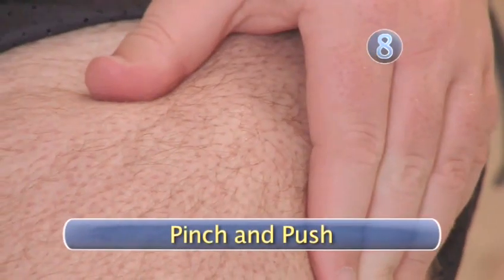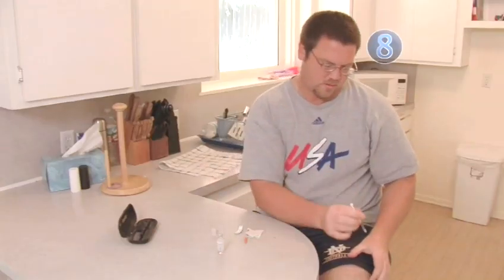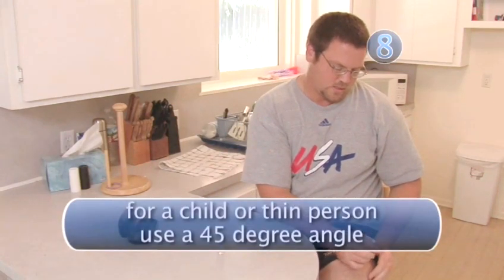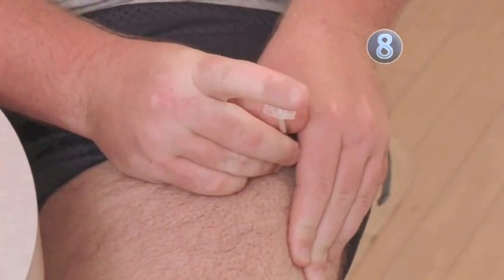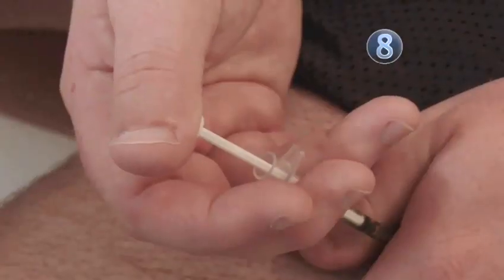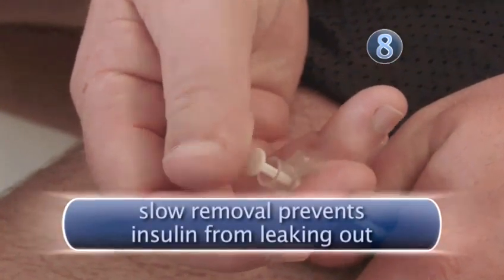Step 8: Pinch and push. Slightly pinch a fold of skin between your thumb and forefinger. Holding the syringe at a 90-degree angle, push the needle all the way into the skin. Let go of the pinched tissue before injecting the insulin. Press the plunger using a slow and steady push. Count slowly to 5 before removing the needle.